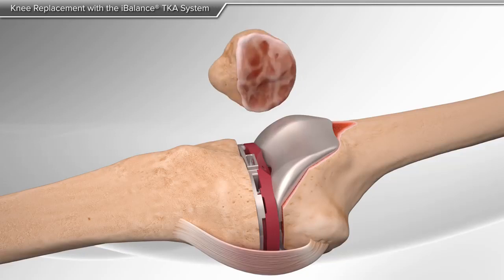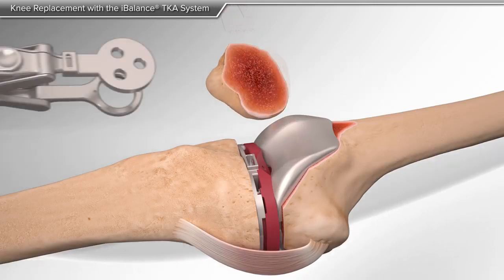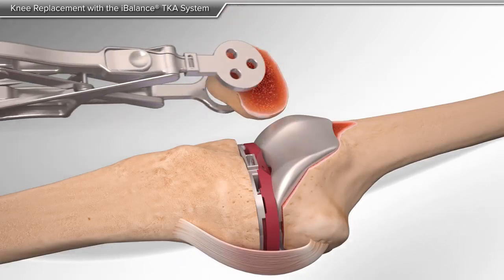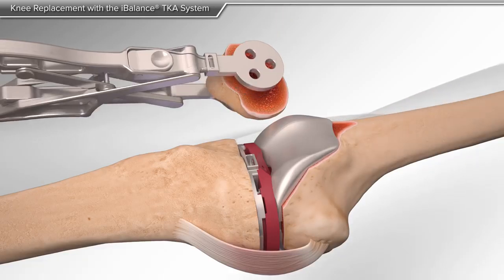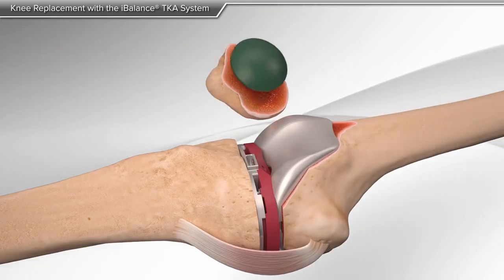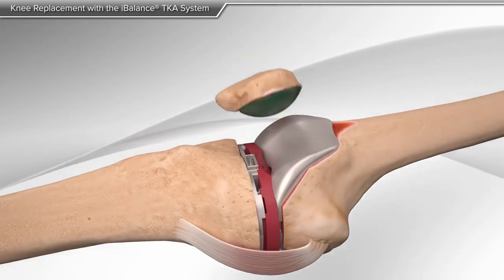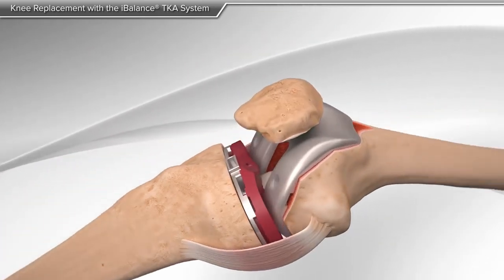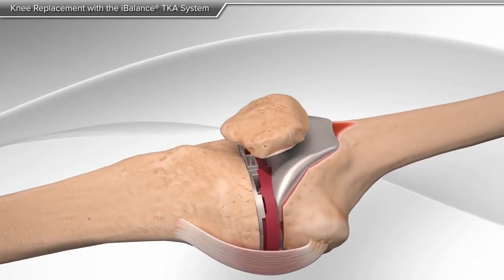Next, your doctor prepares the patella to accept the implant. A trial implant is placed on the patella, and the knee is checked for proper implant size and stability.